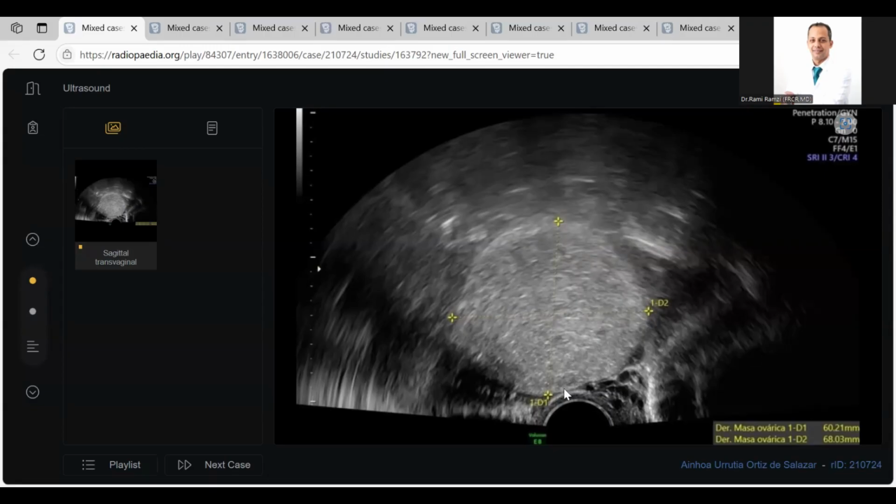I'm trying to identify the adnexa and the uterus, but they are not well seen. This is a limited study. Give me a differential diagnosis. According to a limited study, first of all, I think about fibroid.